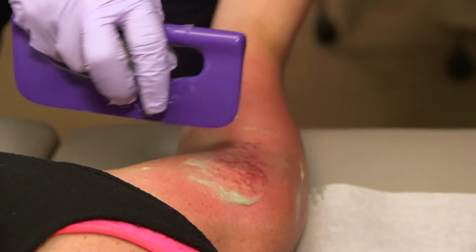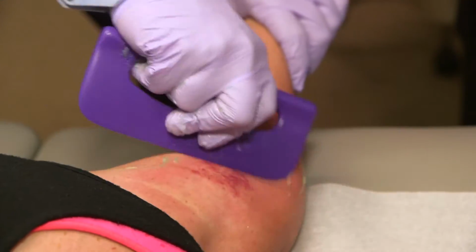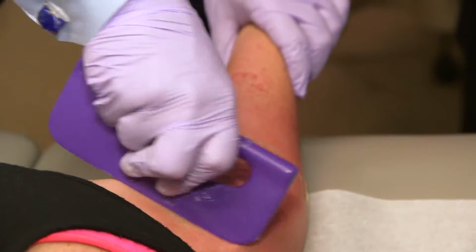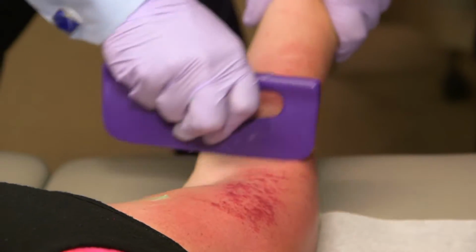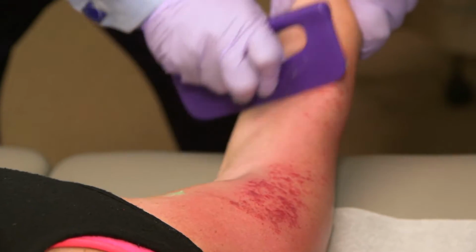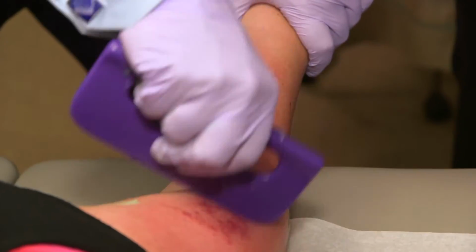Okay, so here, hold on to her arm right here. Pull it out. Good. And we're going to go down her bicep muscle belly. And again, you see the color change.